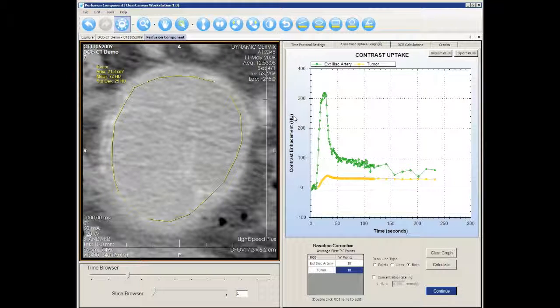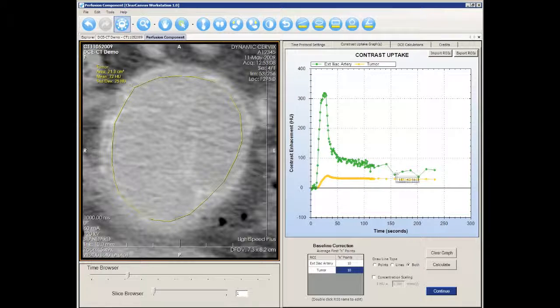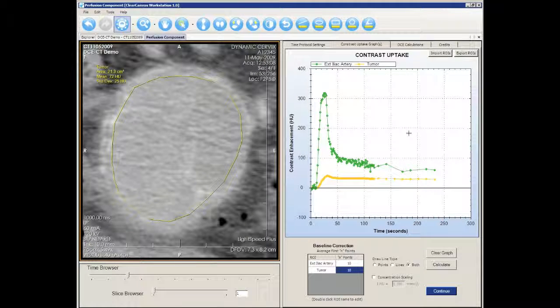In addition, you can remove any extreme outliers in your dataset by right-clicking on any particular outlier and selecting Remove Data Point. This function allows you to reduce noise in your dataset that may be caused by artifact or respiratory motion.